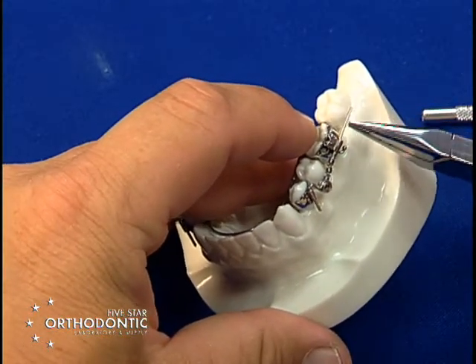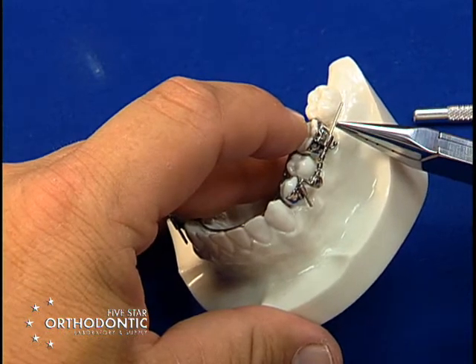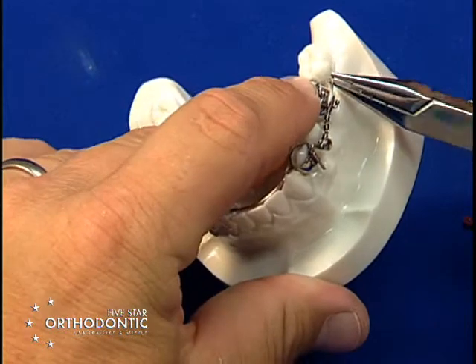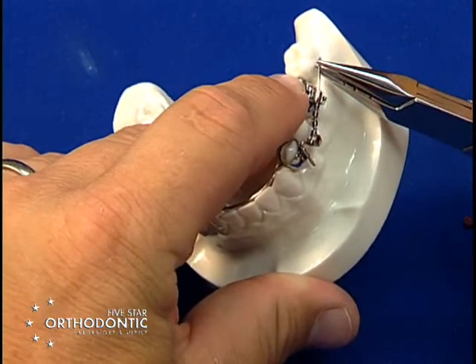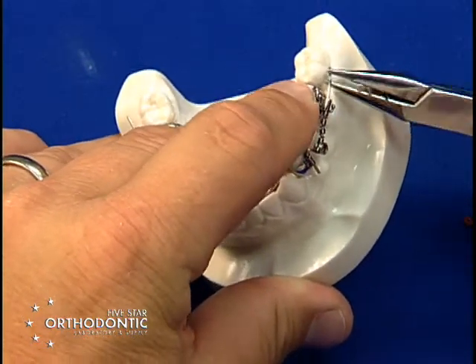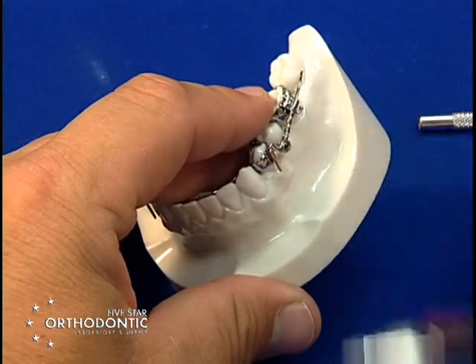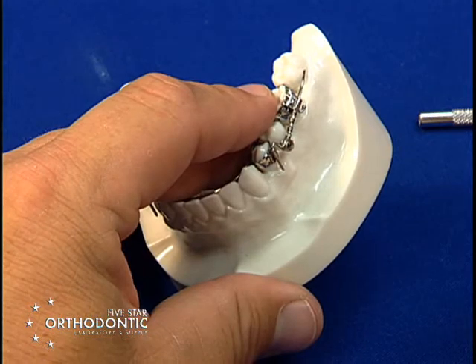Now also, you have two choices here. You can either cut the arm to where the patient can tolerate it, or you can reach back with a Jeraback plier and put an offset bend toward the lingual to get the distal portion of the wire out of contact. Make sure you leave the distal portion straight to allow straight molar distalization.